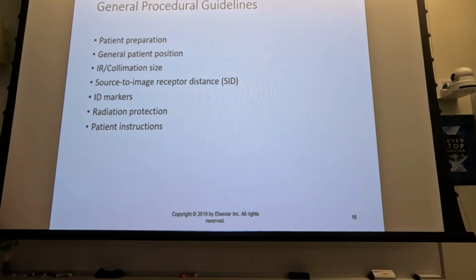So make sure that you pay close attention to the wording of the question. What position is the hand in? Prone, supine, oblique, and what is the projection?